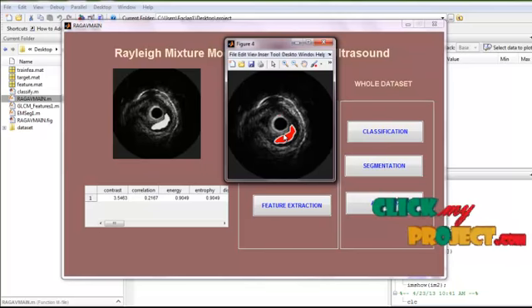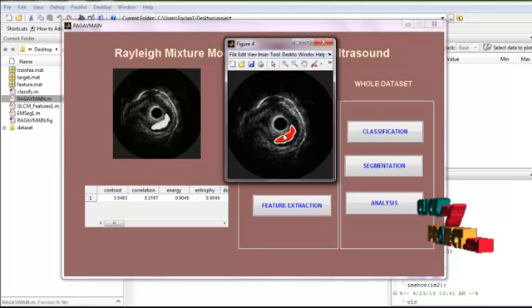The first region growing method was the seeded region growing method. This method takes a set of seeds as input along with the image. The seeds mark each of the image segments. The regions are iteratively grown by comparing all unallocated neighboring pixels to the regions.